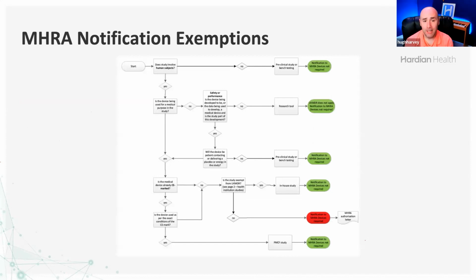This table, sorry, the writing is a little bit small, but we will be showing the slides afterwards. But there is a kind of pathway that the MHRA has published of whether you need MHRA notification or not. In essence, you probably will if you are conducting the study on real world evidence and you're going for UKCA or CE marking.